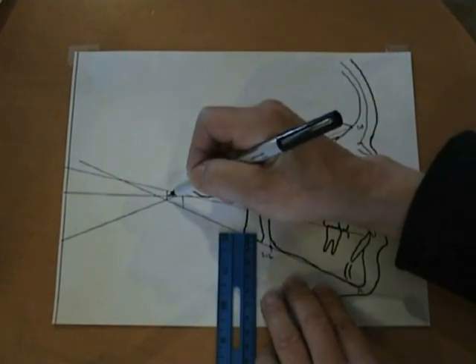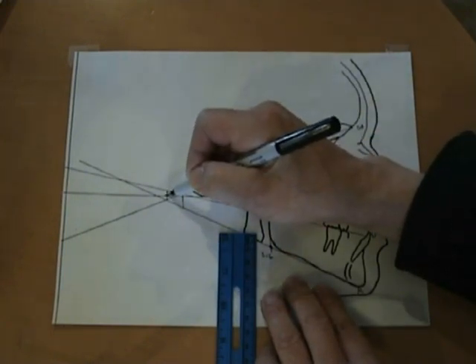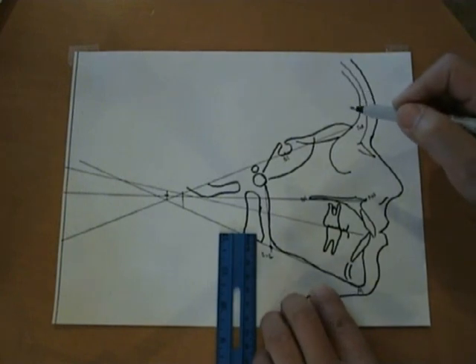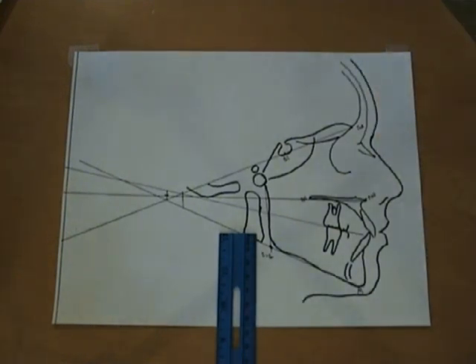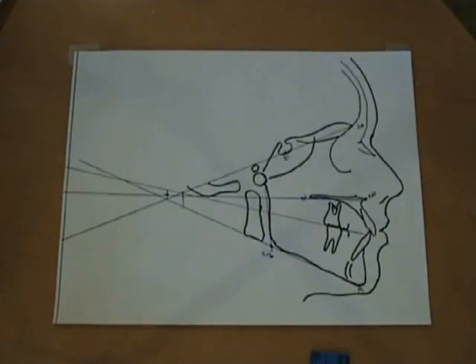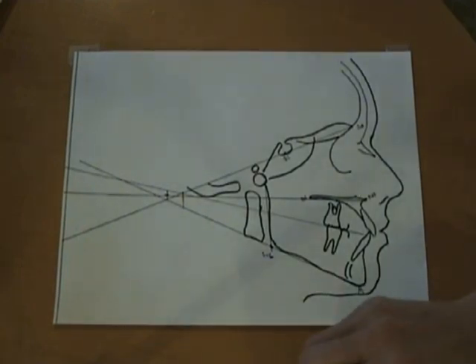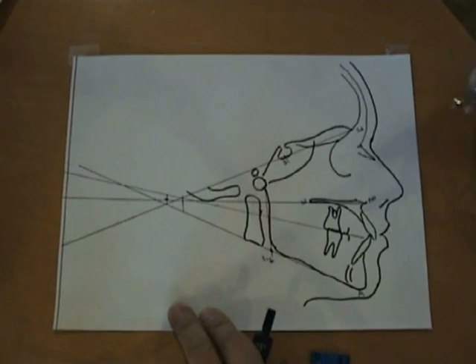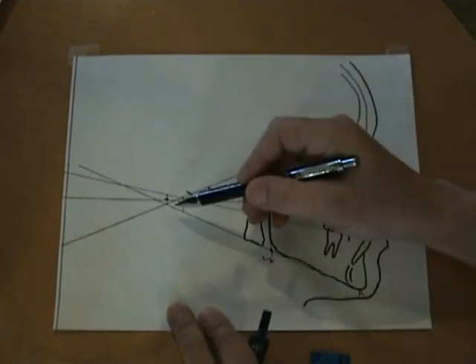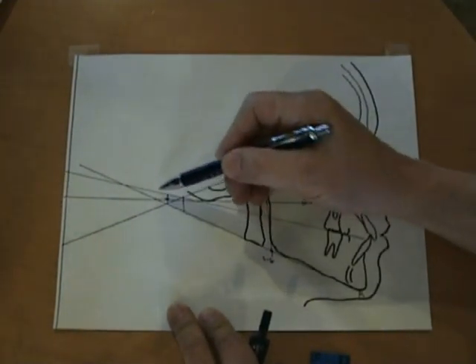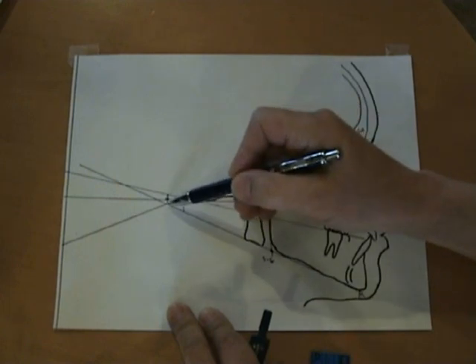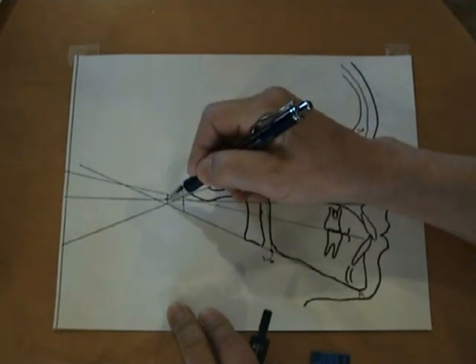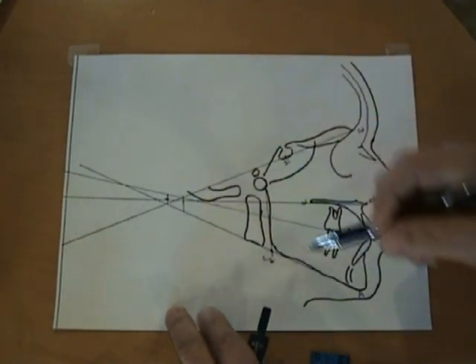So Center O is the midpoint of that vertical line. Let me repeat that, Center O is the shortest distance from the most superior plane to the most inferior plane. The shortest distance, and this is the midpoint right here, and that's considered Center O.